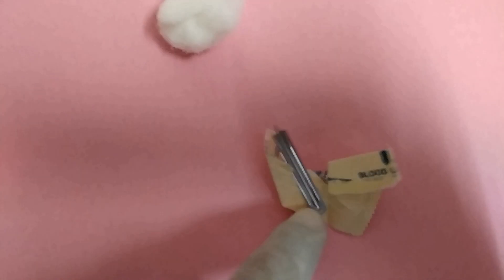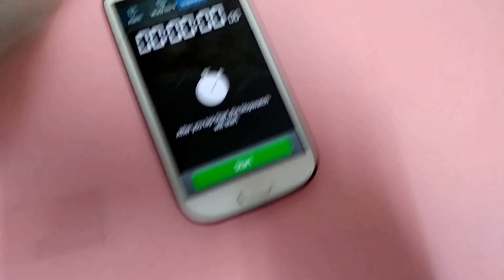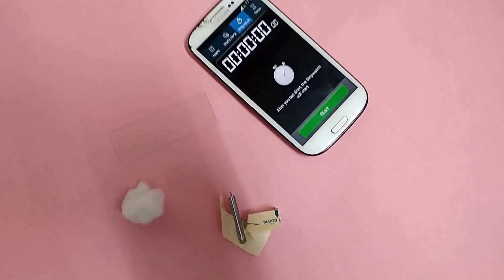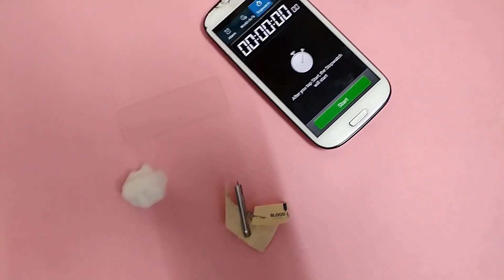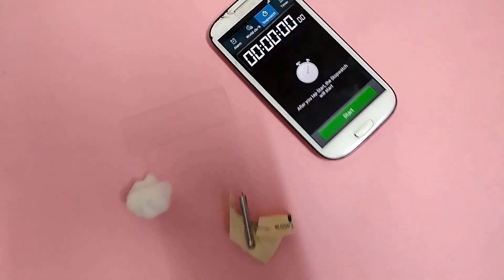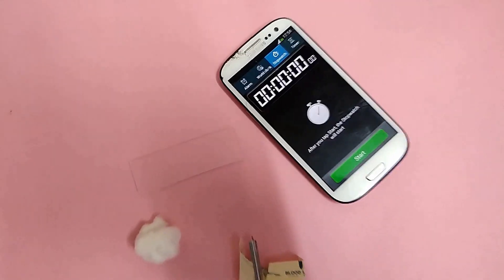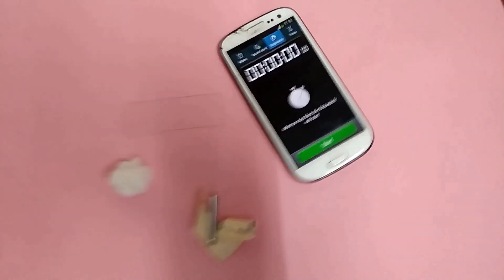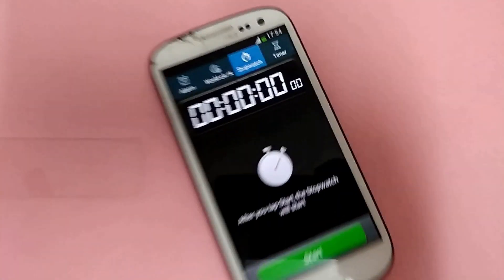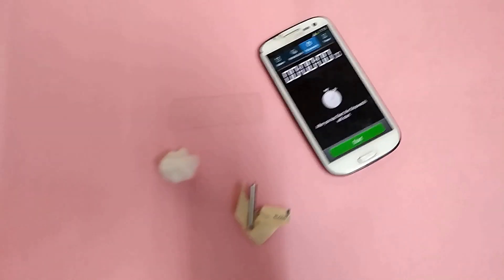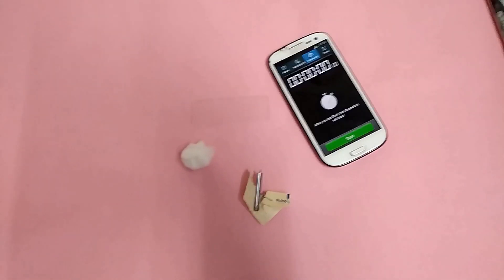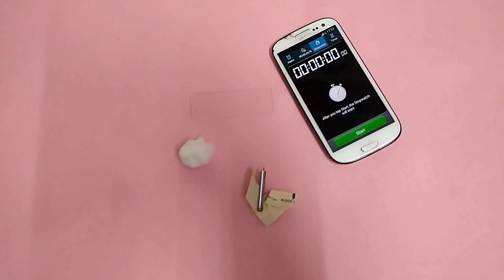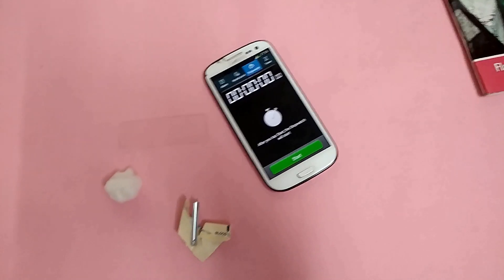Blood clotting time determination by slide method. Requirements: slide, lancet, spirit swab, stopwatch, present in mobile.